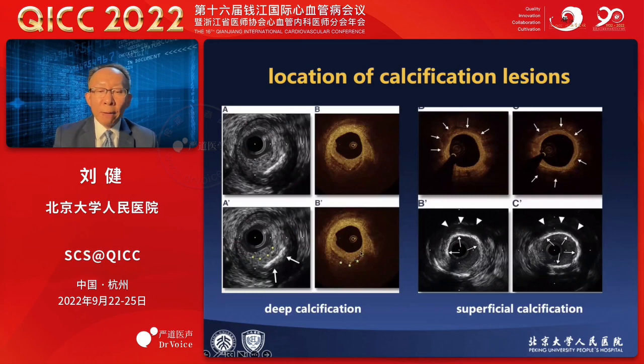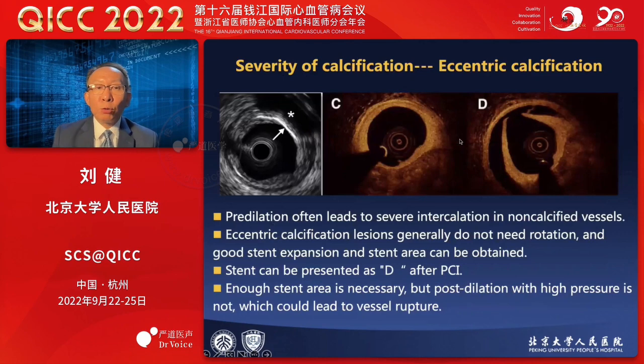According to the angle of the calcification by OCT, you can see the fibrous cap and also the deep calcification. And these are the superficial calcifications. The intima is thin and there is a pretty large calcification. So you can have a good differentiation between different features. And here you can see the eccentric lesion. Does the eccentric lesion make a difference in the outcome?